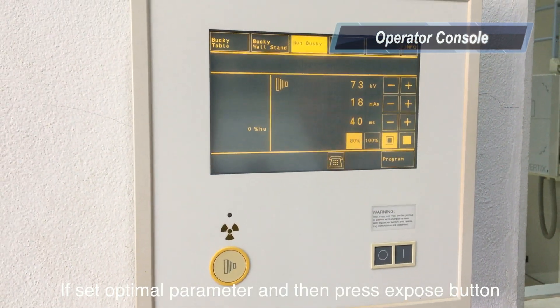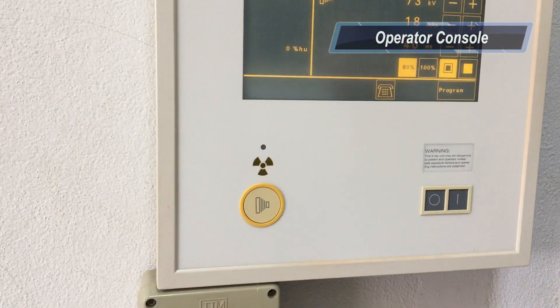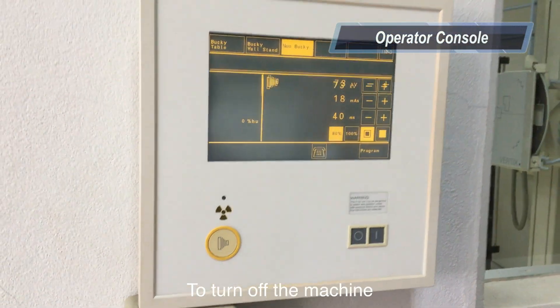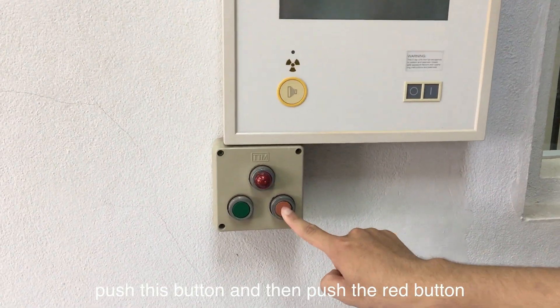If you set the optimal parameters, then press your exposure button. To turn off the machine, push this button and then push the red button.